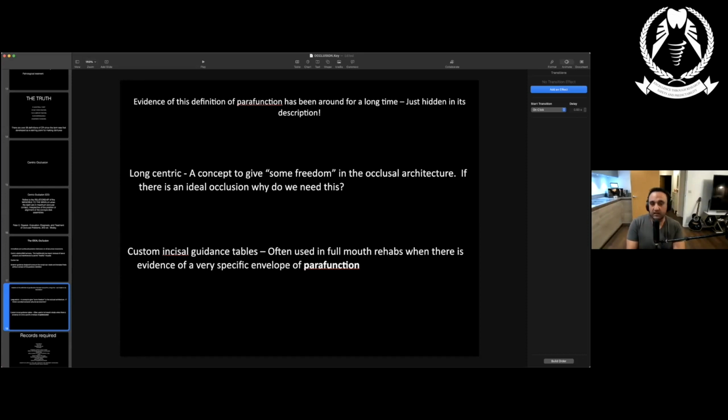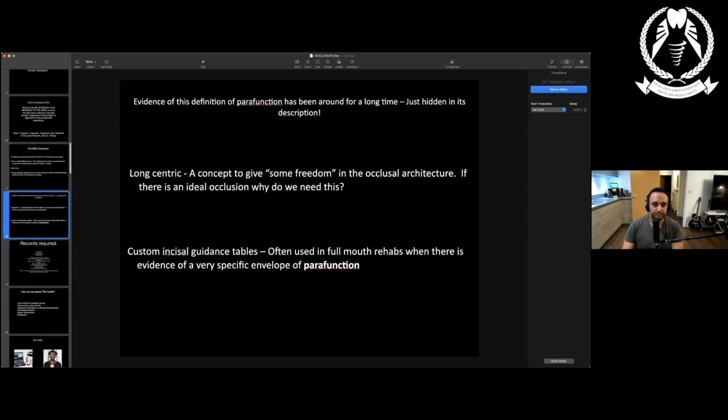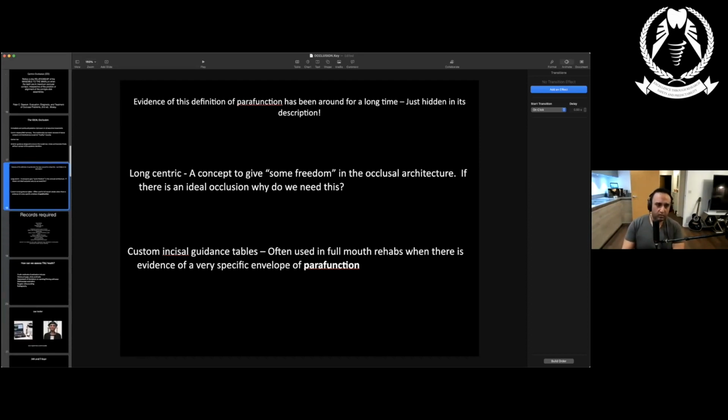So again, in the advent of the digital world now, it's really cool because using various intraoral scans, we're able to actually record the movements of the mandible, the maxilla, and how the teeth were initially by a simple intraoral scan, which now takes minutes to do as opposed to hours. So all of this is great, but what do we need to record? What do we need to medico-legally record for our patients to make sure that everything is down?